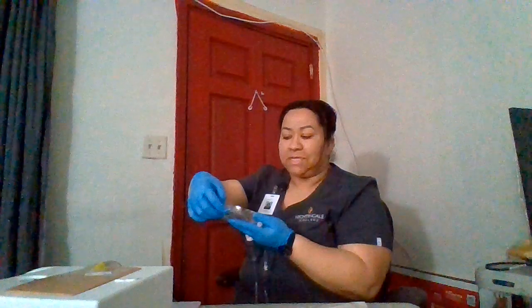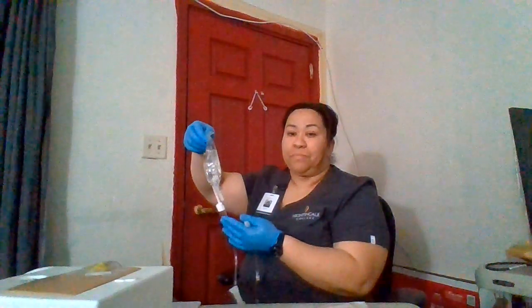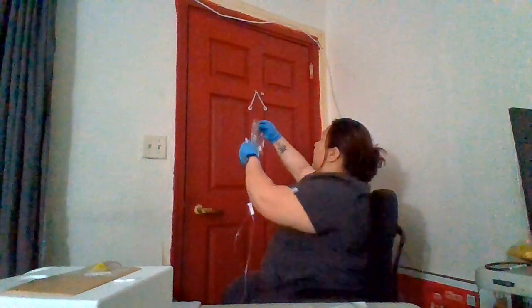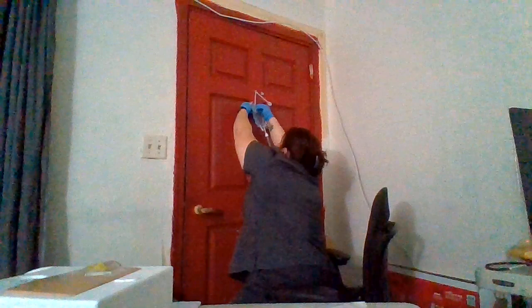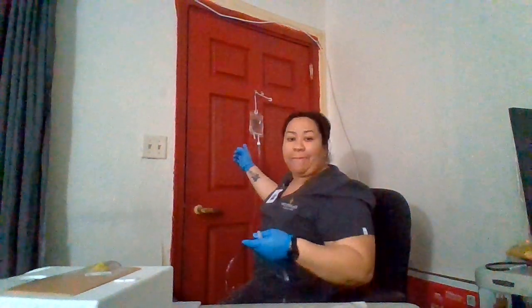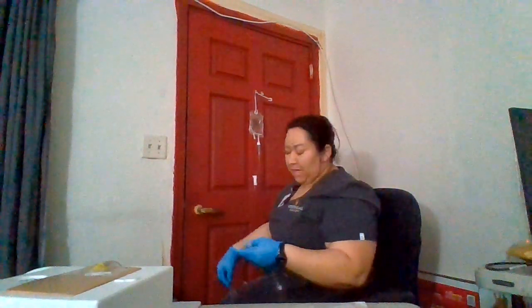When we hang it, it has to be at least 30 inches from the patient's IV site. I'm hanging it on the lower part since I will be having a piggyback.